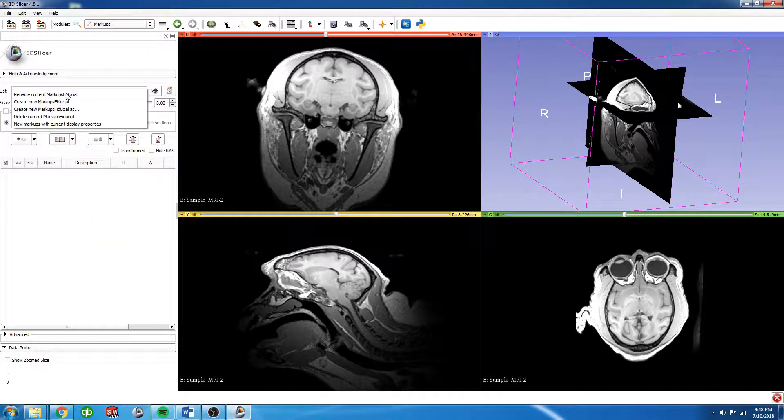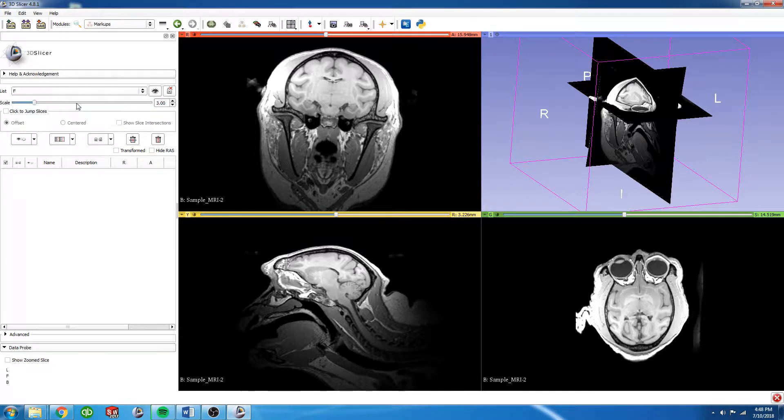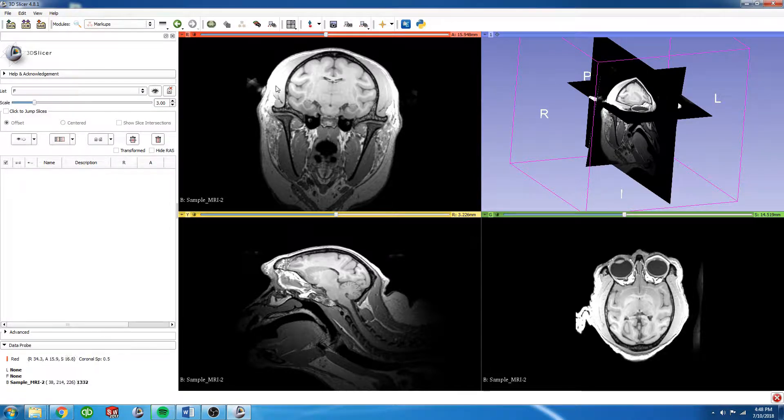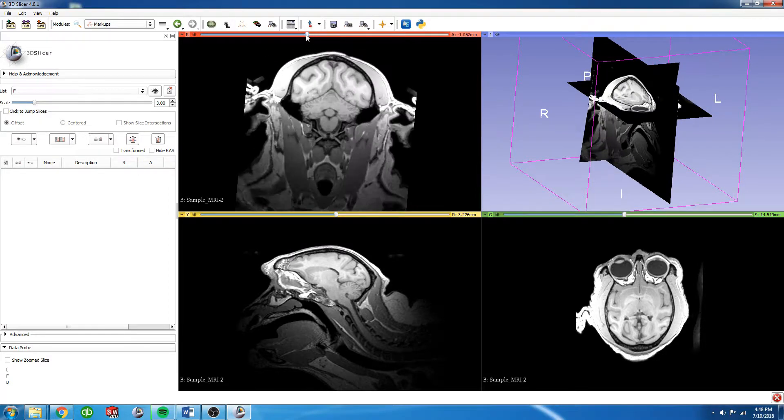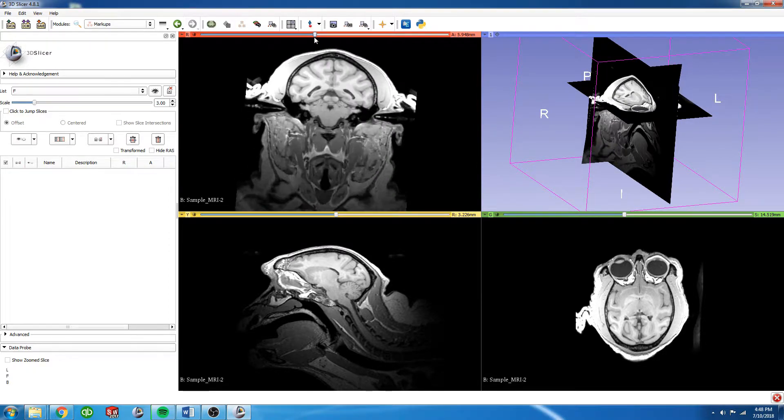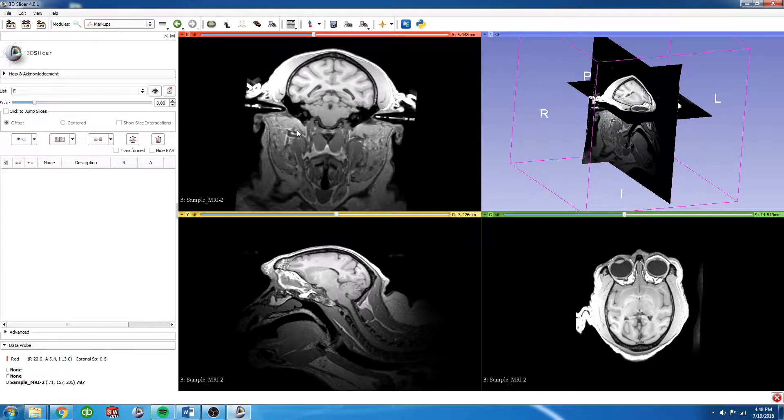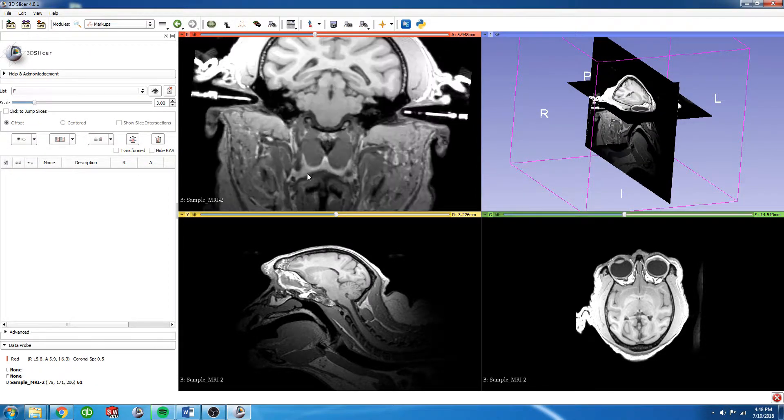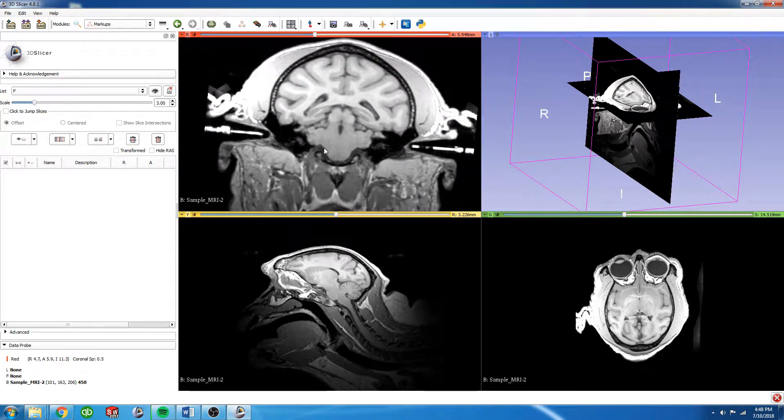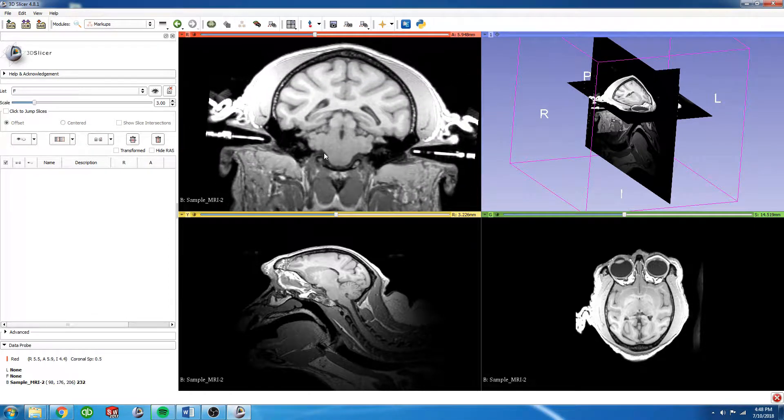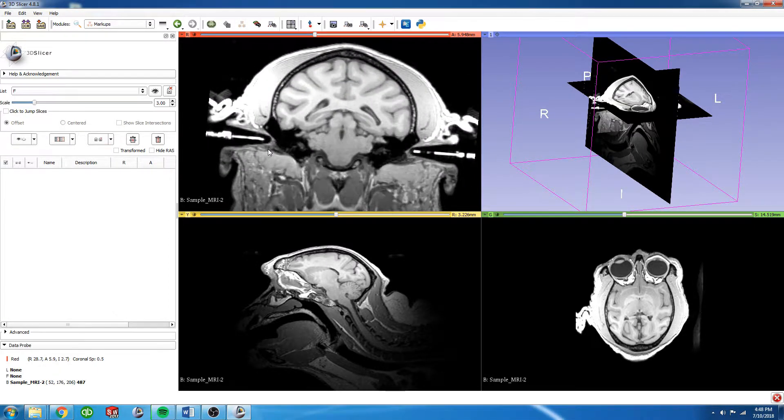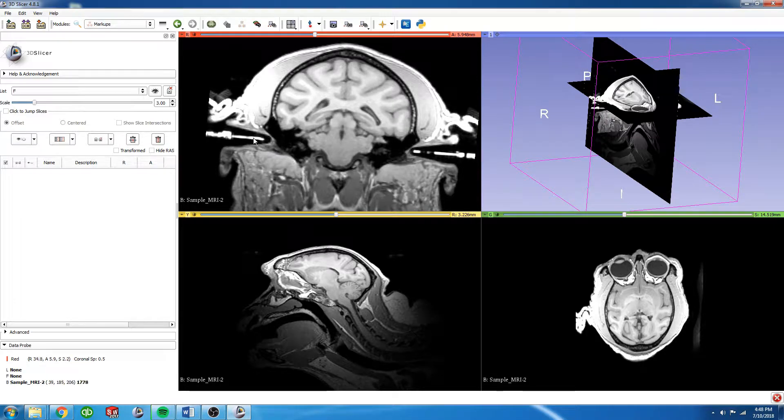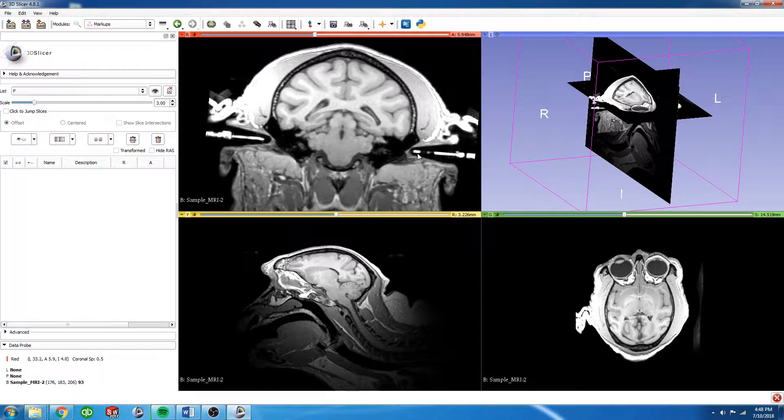We're going to create a new markups fiducial list and then we're going to go into the coronal view for now and look for the ear bars, or the ear canals more specifically. This MRI has everything pretty well aligned. The ear bars are pretty centered in the ear canal, so I'm just going to use the ear bars as my locations for the fiducials.